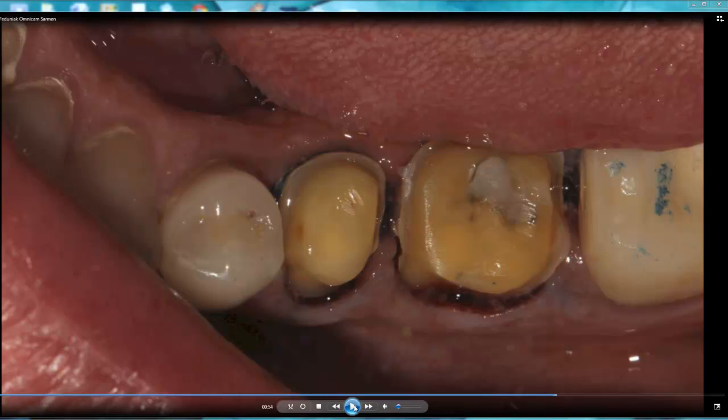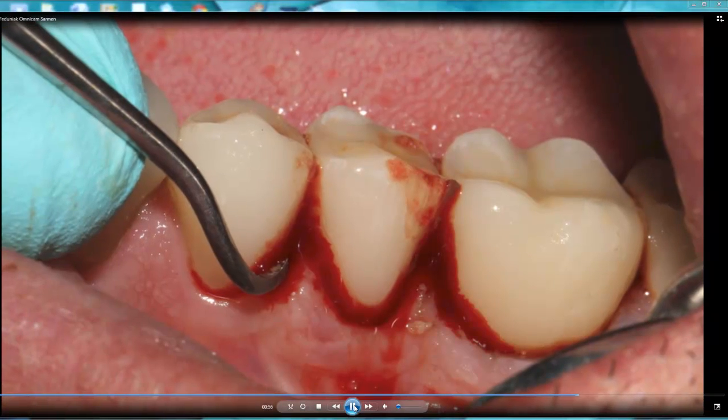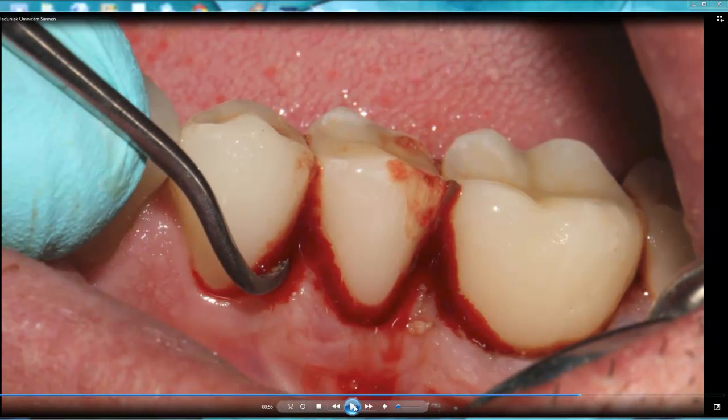So in this case, I'm going to use the dentin bonding protocol, and I'm going to use All-Bond Universal from Bisco company as the bonding agent, and I'm also going to use Unicem 2 as my final cement. So that's the protocol I have, when I cement my crowns.